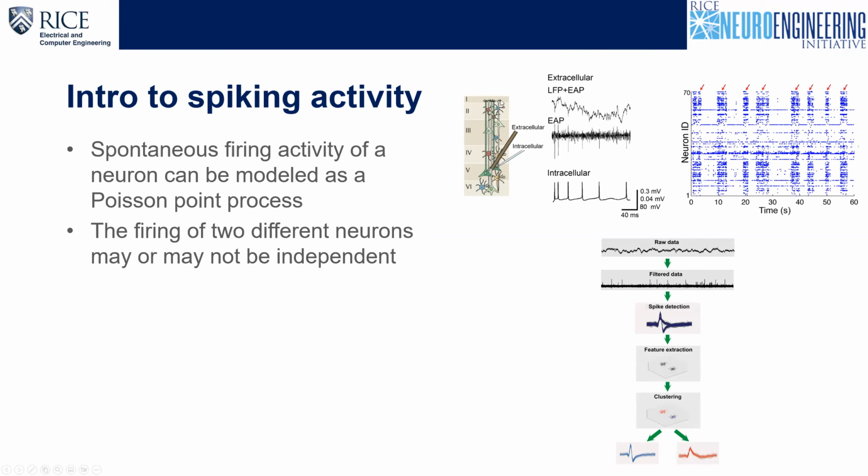So naturally, when our electrode goes inside, there is a very, very small chance that it would actually hit a neuron or actually start measuring intracellularly. Intracellular would mean that you're measuring voltages from within the cell. Obviously, it's a very small chance that you would actually go inside the neuron. So 99% of our recording is extracellular, which means we're measuring electrical signals outside the cell. All of these voltage traces that I showed were outside the cell.